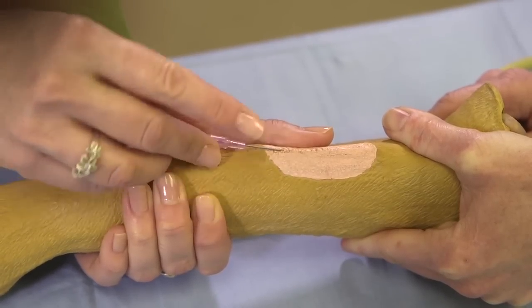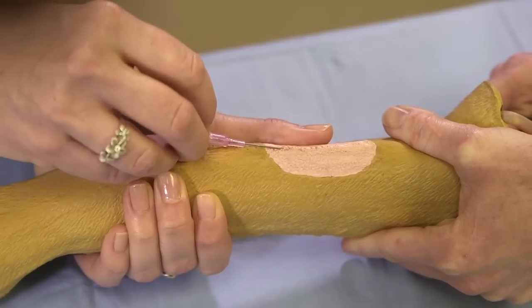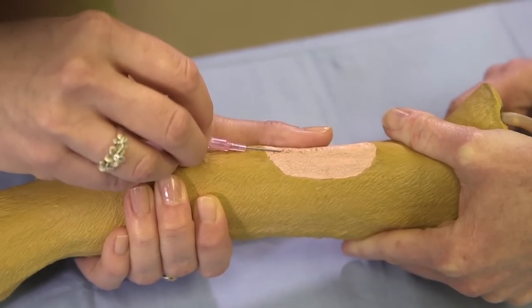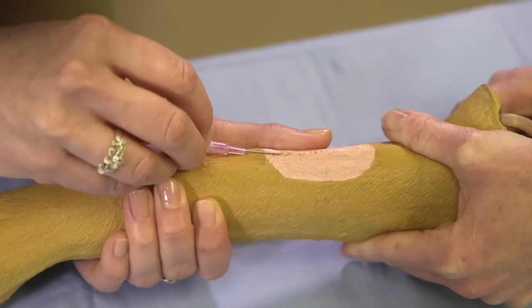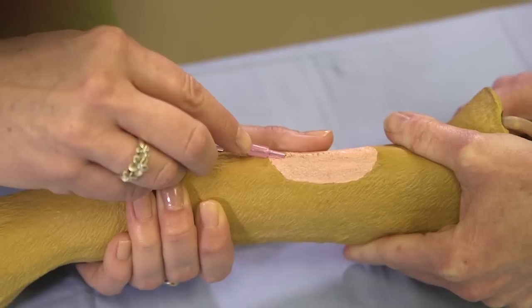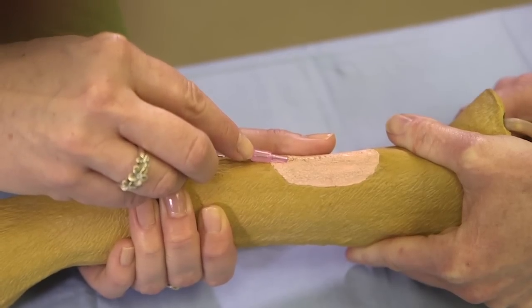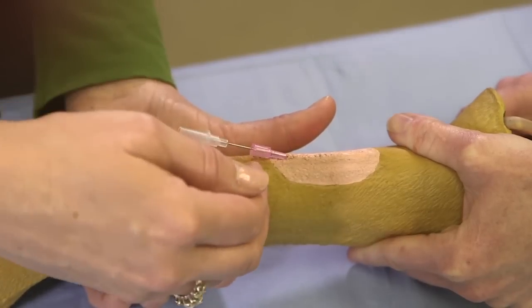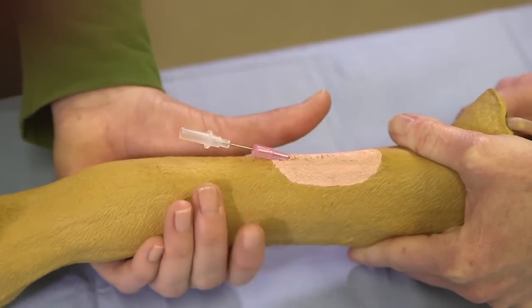Hang on to your stylet and poke into the vein. I've got my first finger here ready to push that catheter off. I'm going to hold still where my fingers are, hold my stylet still, and push that catheter off into the vein. Then once I pull my stylet out, the blood is going to want to gush out of the catheter.